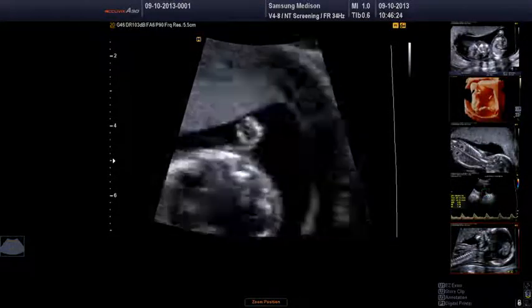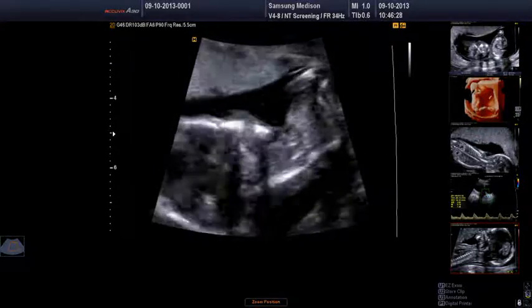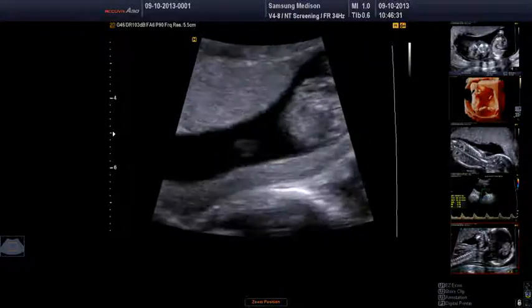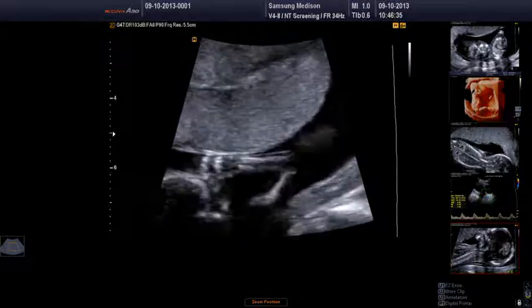And then just looking at arms and hands, so just checking there's two bones in the forearm. There was one hand that we could see there, that's the other hand there. That's great.